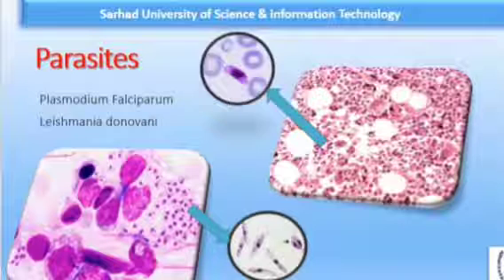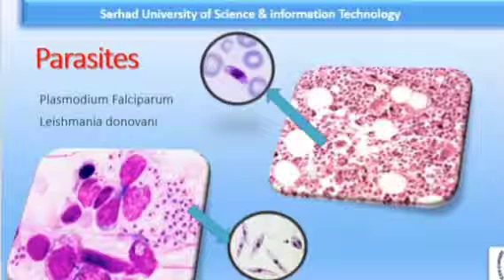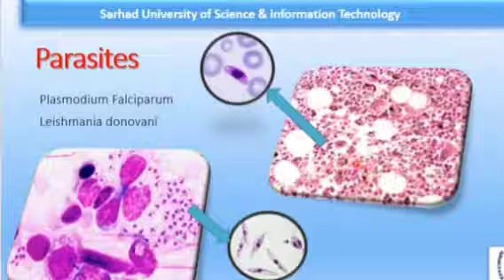You are examining for the presence of parasites, particularly Plasmodium falciparum. Like this is a bone marrow smear, and here you are looking, it's zoomed.